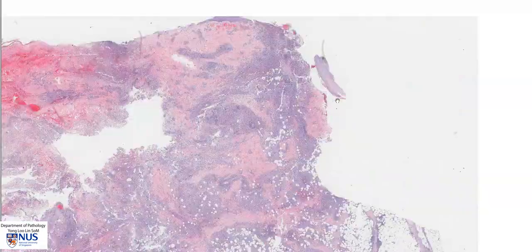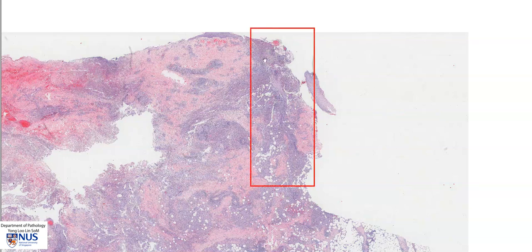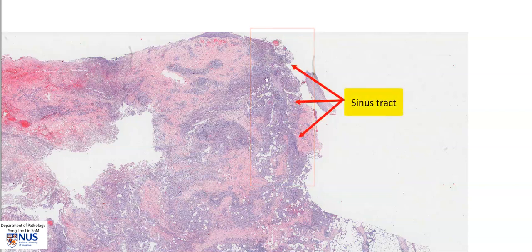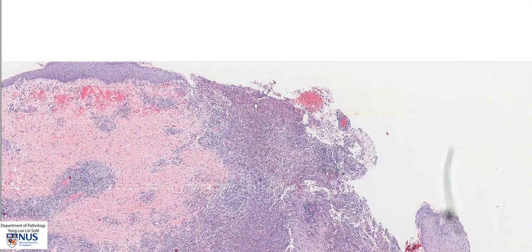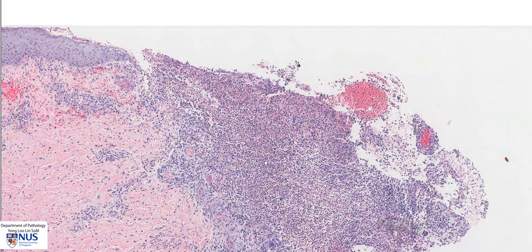Here, towards the right edge of this specimen, we can see that there is almost a vague vertical tract, and this vertical tract is composed of acute suppurative inflammation. This is a sinus tract where the acute suppurative inflammation opens back up into the skin surface, so this would appear clinically as a sinus tract that is discharging purulent material.